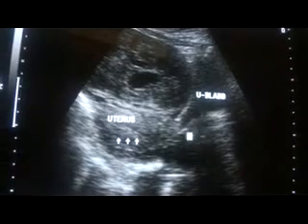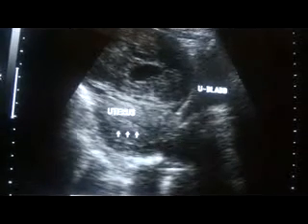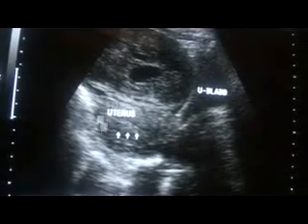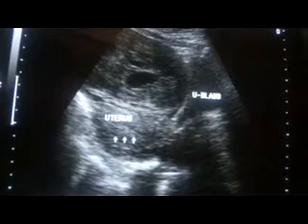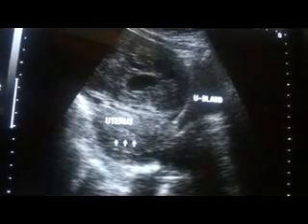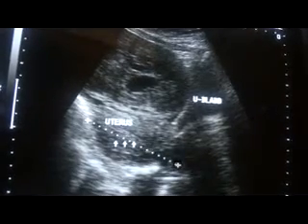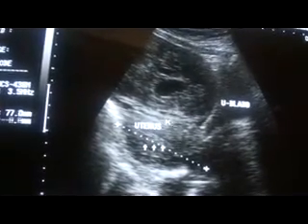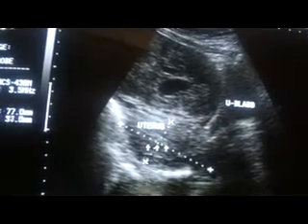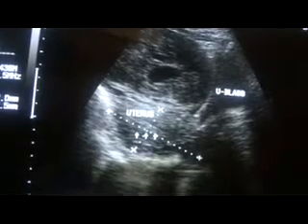I am not provided with any detailed history or gynecological examination. No lab findings are with me. So I have to go by my own experience. Now as I move the probe upwards, I can see that this cystic area persists within this mixed echo mass.